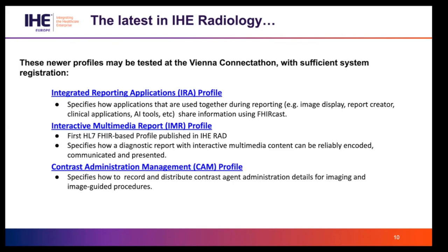Interactive multimedia report profile is the first building block which the IDR profile essentially extends. It deals specifically with the ability to include links to multimedia, meaning the imaging results or images, or eventually some video and other content that may be augmenting the diagnostic report.